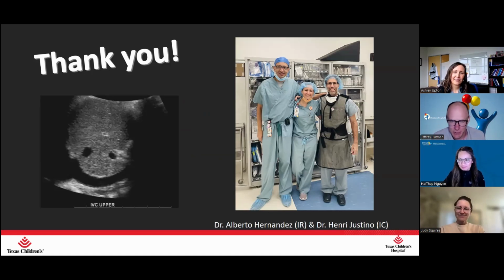If anybody has any questions, feel free to submit those in the chat. I know I certainly have a lot of questions. I'd love to hear from Judy and Haitwi as well. I'd love to hear a little bit, from a practical approach, how you're approaching these patients. If you get a request for evaluating for portal hypertension, are you routinely doing a very comprehensive assessment with a full right upper quadrant exam with Doppler and elastography? What's your general approach to those kinds of patients?